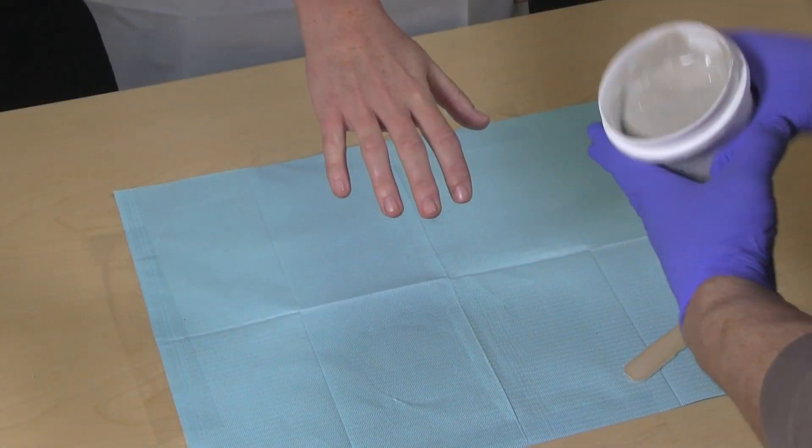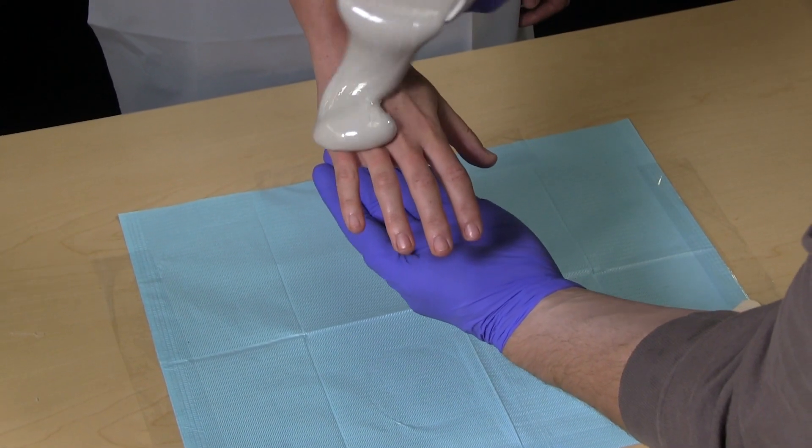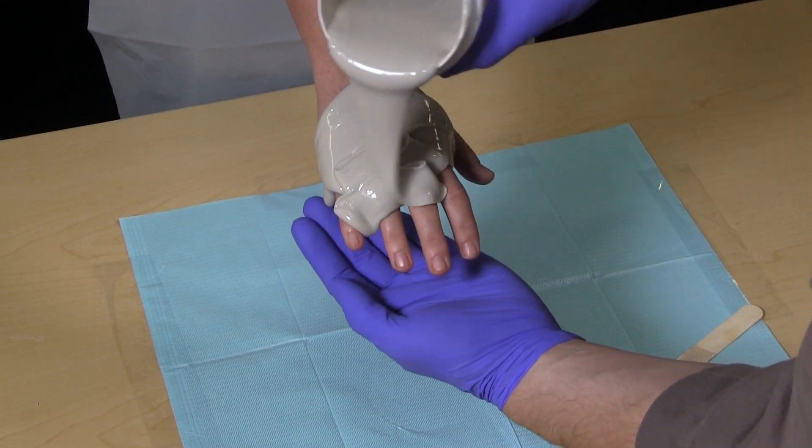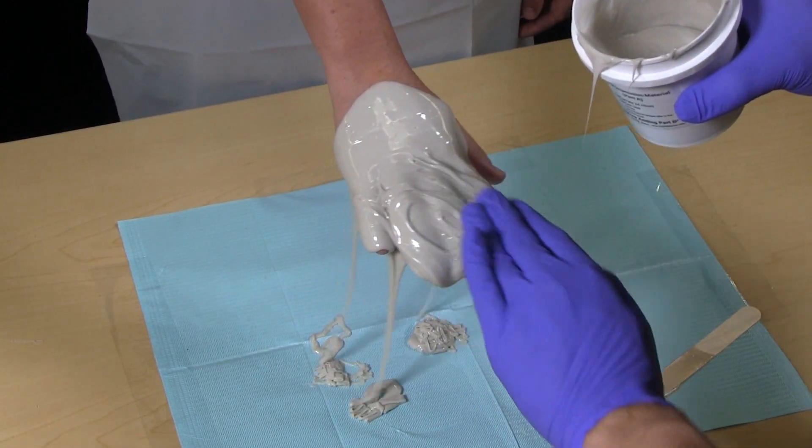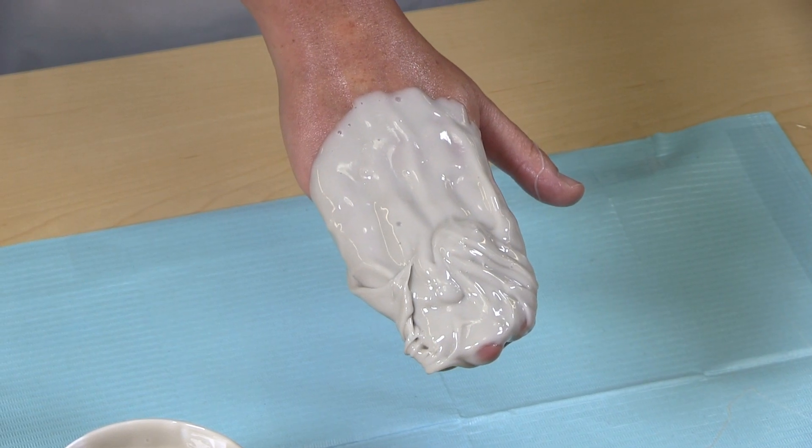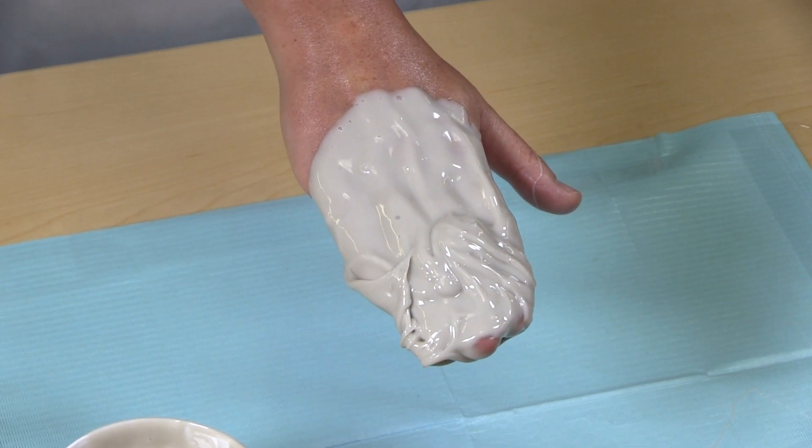Apply the activated impression material generously to the customer's hand. This should be done quickly and thoroughly. Do not allow the patient to strain the fingers or other unnatural positions. Make sure the impression material covers the hand up to the thumb webbing.